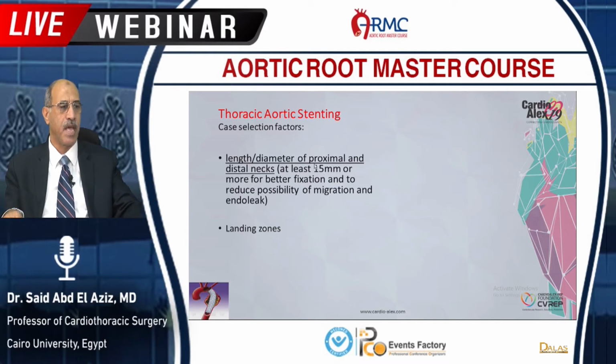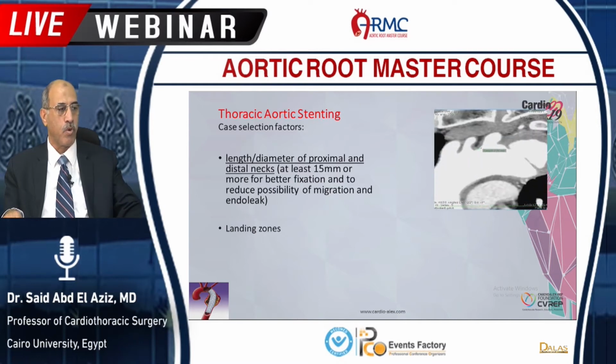The length and the diameter of the proximal and distal necks. At least we need 15 millimeter or more for better fixation and to reduce the possibility of migration and endoleak, which we call the landing zone. Here we have a type B dissection, and here it is just distal to the subclavian artery. So the distance from the carotid to the subclavian artery is very narrow. So this is not a good landing zone.